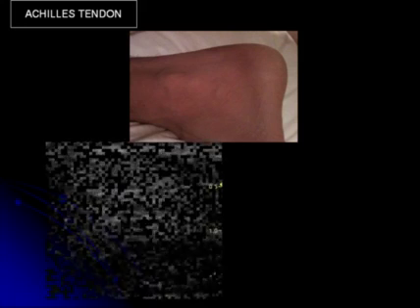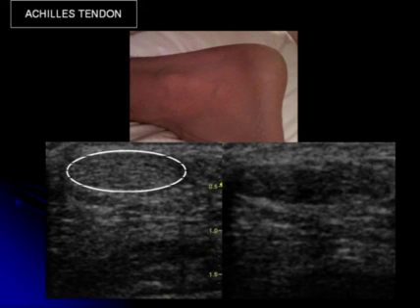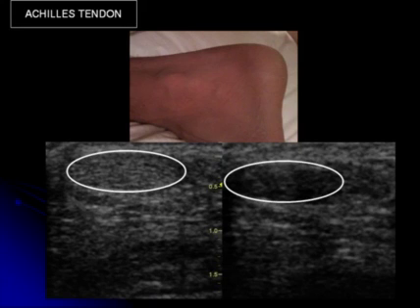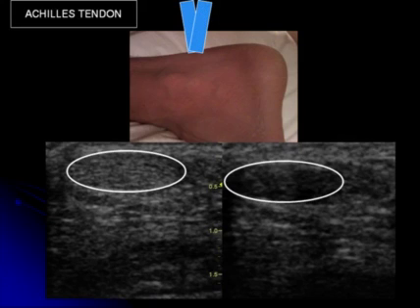Here is a demonstration in the transverse plane of the phenomenon of anisotropy. You have the Achilles tendon seen on two images. The one on the left is a hyperechoic tendon when the sound is at 90 degrees to the tendon. The one on the right shows anisotropy when the transducer in the transverse plane had an abnormal angle.